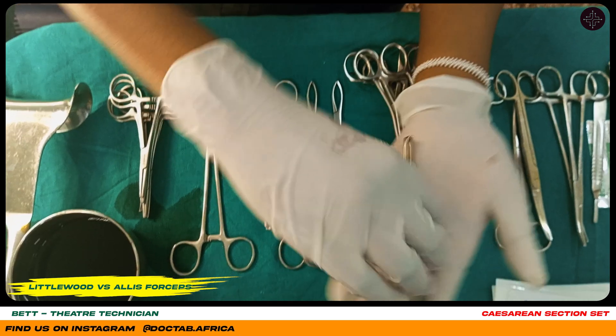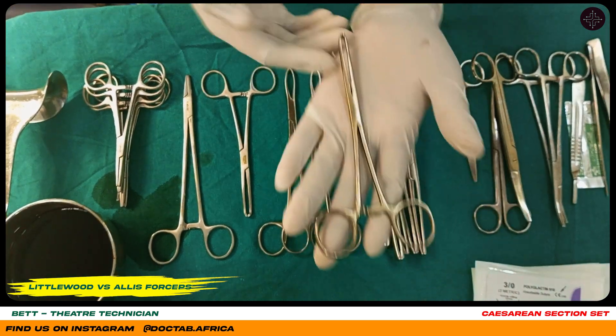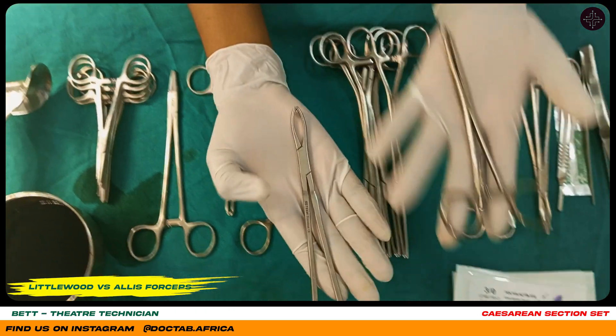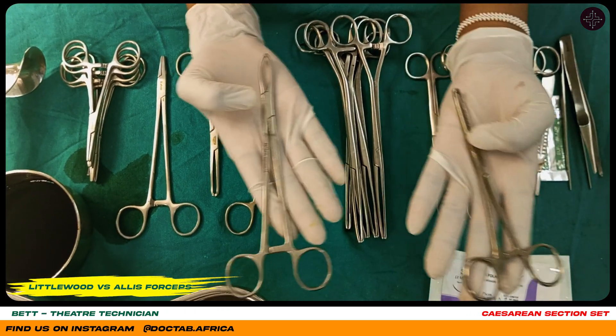This is my Allis forceps. To differentiate it from the Littlewood: the Littlewood has hips, the Allis doesn't.